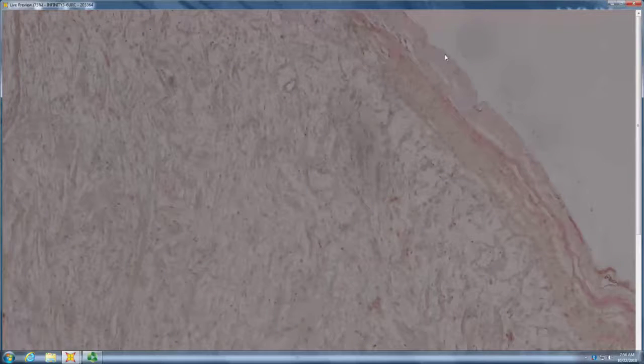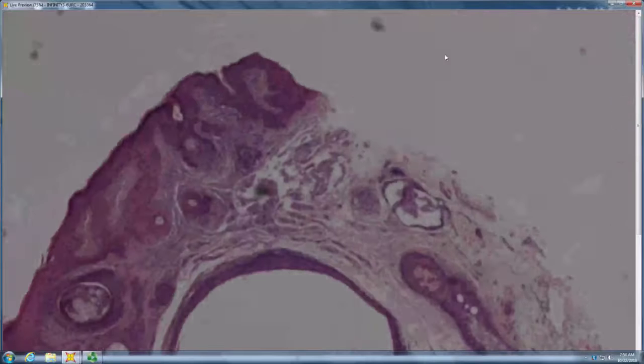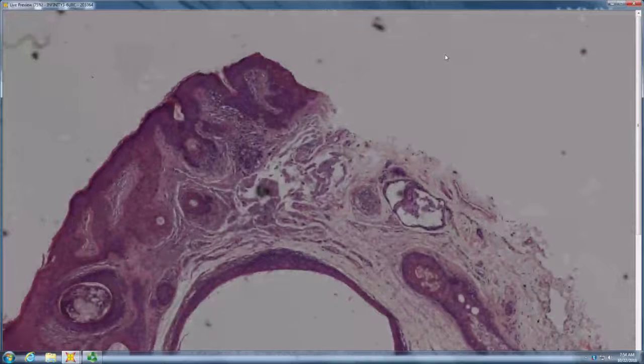It is kind of oval, not particularly round. The other thing it could be is an intradermal or an intraneural neurofibroma. Probably the best way to tell them apart would be a neurofilament stain. And this had little crisscross neurofilaments through the whole thing. That favors which of the two? The latter, the intraneural neurofibroma, whereas a schwannoma wouldn't have that.